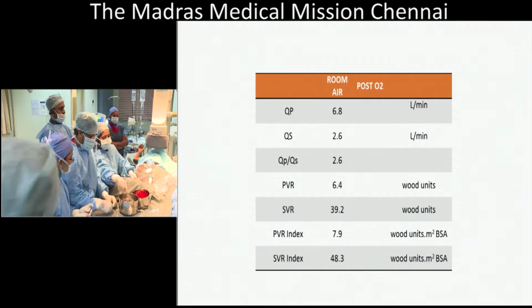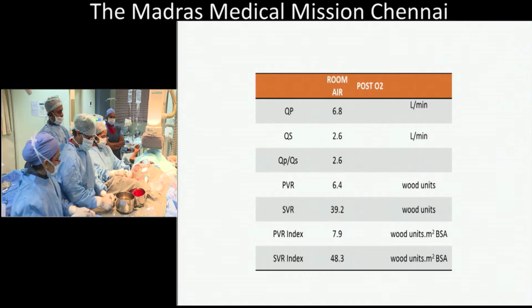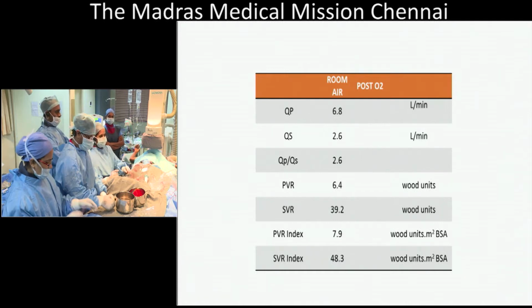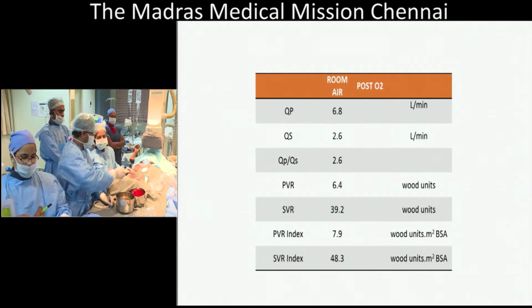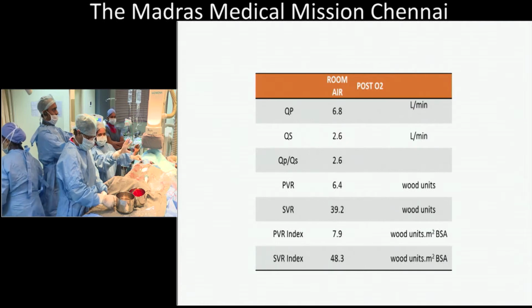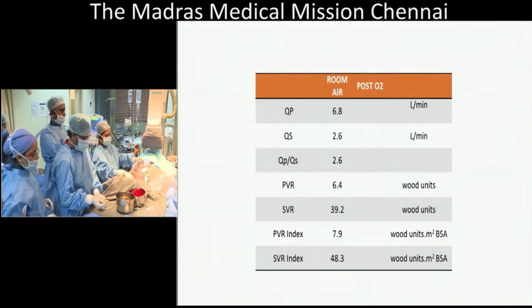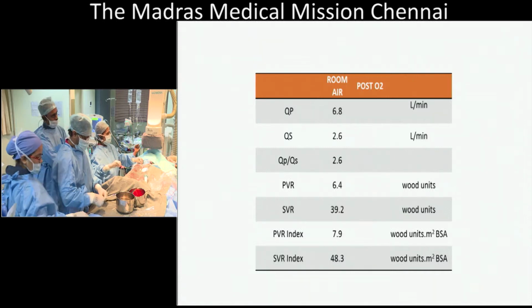We have really looked at our data in this particular subset of patients. These are young adults, and this subset is very commonly seen in India and other eastern parts of the world. These are young adults who have significant pulmonary hypertension, and some of them come with a very large baseline shunt and have a low pulmonary artery diastolic pressure and a very large anatomical defect. These are the patients who are known to do very well following closure on pulmonary vasodilators, with most of them pressures dropping to less than 50%. In the long run.